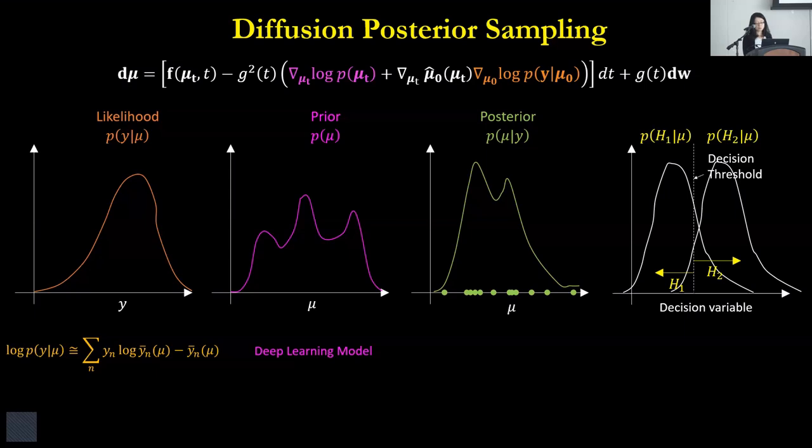Even if we can choose an optimal sample, it's very likely that the optimal sample depends on the imaging task. And in very complex clinical scenarios where radiologists need to make multiple decisions, it's very unclear what is the optimal sample that we should present.